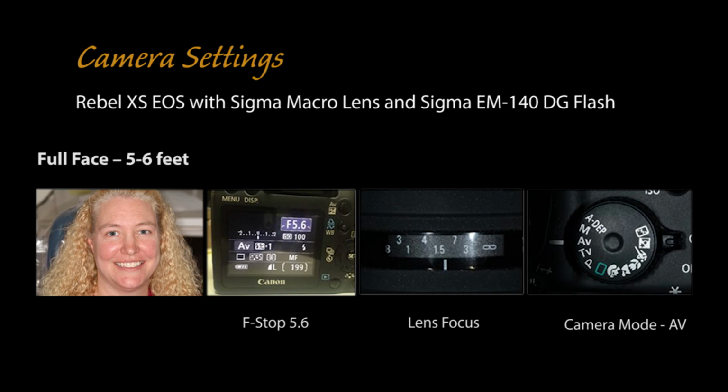If I don't know what tooth to pick, and I'm just going to randomly pick a tooth based off of the oral cavity arch that you gave me, I may pick too square of a tooth for a patient. So on Mindy here, she has a little bit more of that tapered ovoid face. I wouldn't want to grab a real boxy square tooth and set that in the denture setup because the tooth would look too aggressive. It'd look too square. So we like to see these types of pictures, particularly on the removable side and even on the fixed side, just to understand what tooth shape we're trying to match to the face.